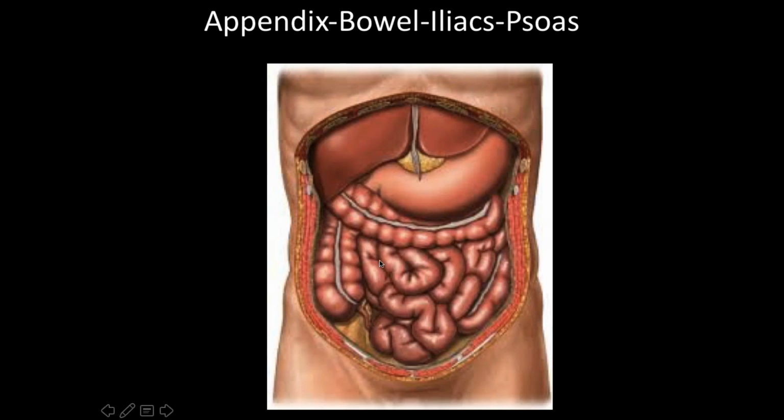So initially, when you put your ultrasound transducer on, you're going to have small bowel on the right hand of that ultrasound screen. As you can see here, it's small bowel, and for the most part, the ascending colon is going to be on the left hand of that ultrasound screen, and so it correlates well. It's on the left hand on this diagram as well. It's at the right lateral position, and you can see the appendix coming off the base of that cecum.